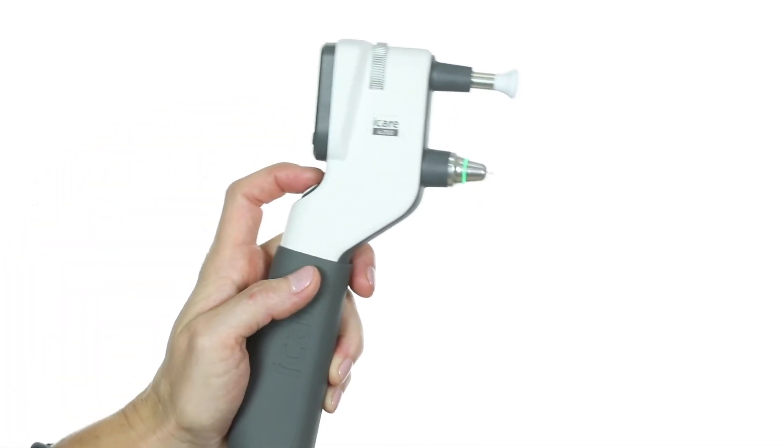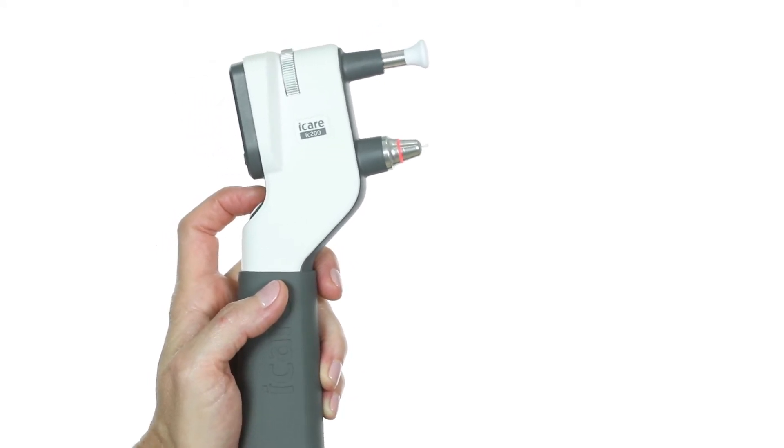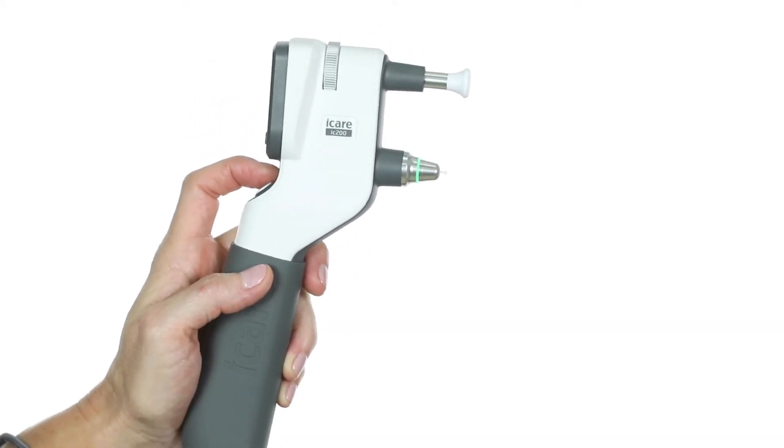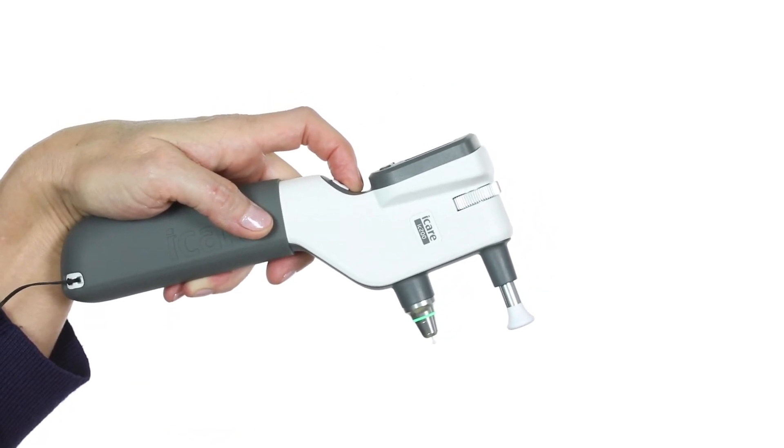If the probe base light is red, the device is tilted too far upward. The green probe base light indicates proper alignment when taking a measurement in sitting, supine, or any position in between.